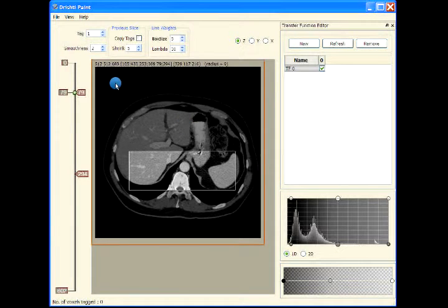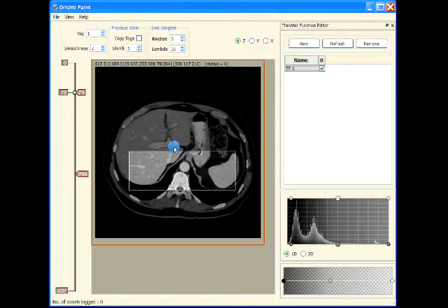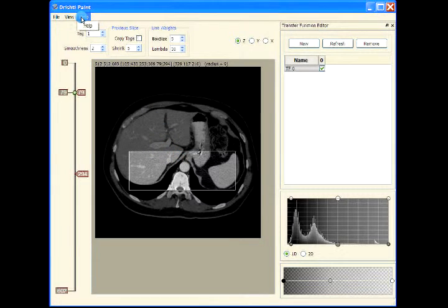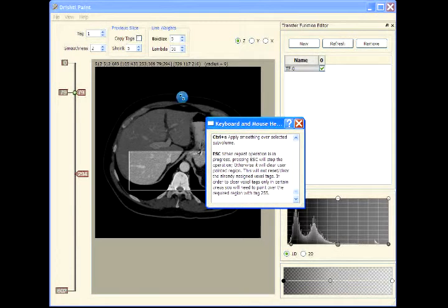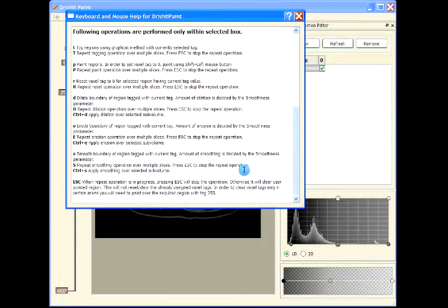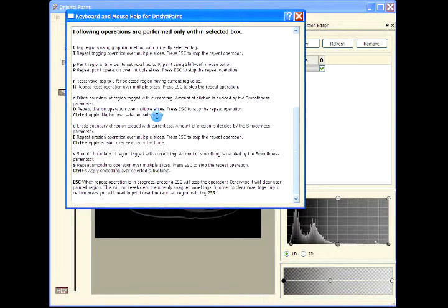Instead of dilating one step in Z direction and then Y direction and so on, I'll press Ctrl+D. Rather than applying the dilation over multiple slices, Ctrl+D will apply dilation over the selected sub-volume.